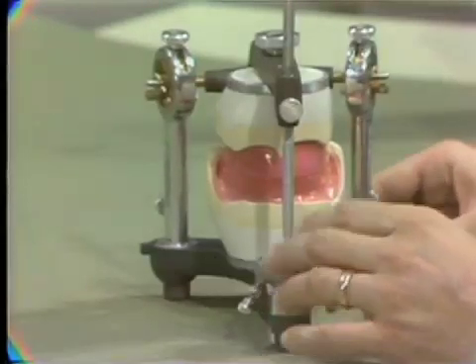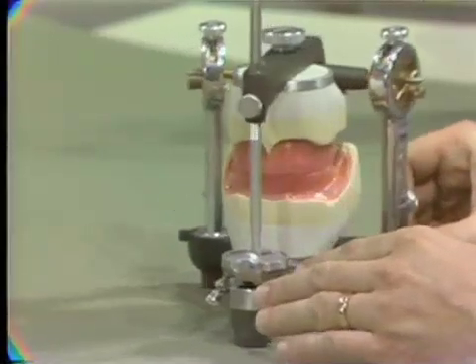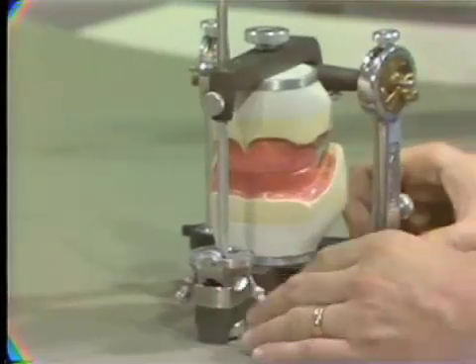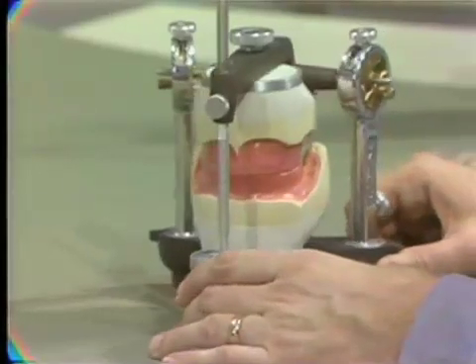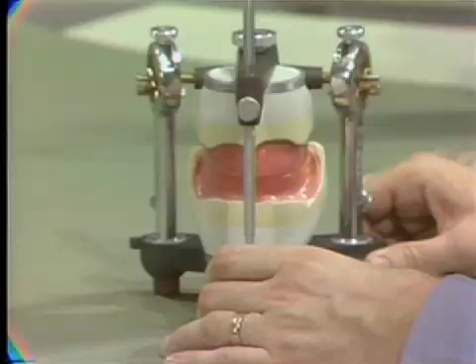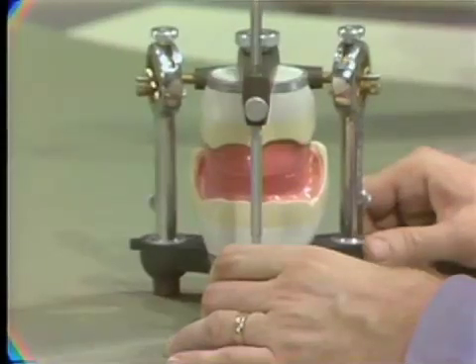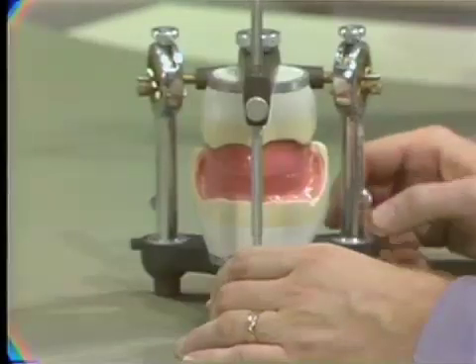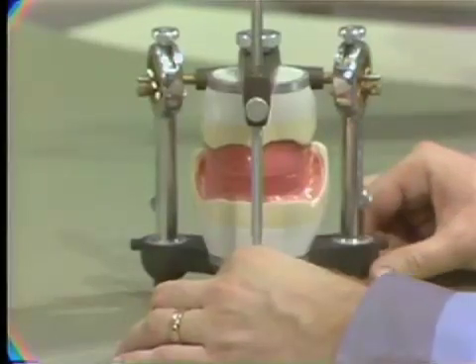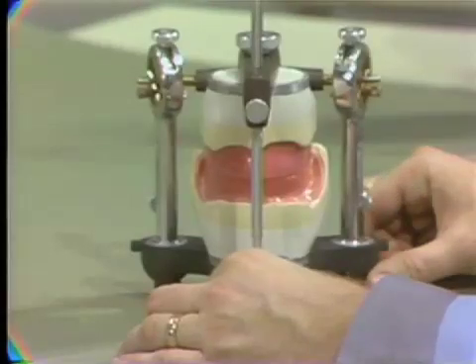Now, we're going to insist in this exercise that your mountings be neat and trimmed, as are these, and your articulator be free of excess wax and plaster. The first step in setting the anterior teeth is to locate the midline on the wax rim so we can line the central incisors in such a way that the midline, of course, is correct. This is done in the patient by using the face.